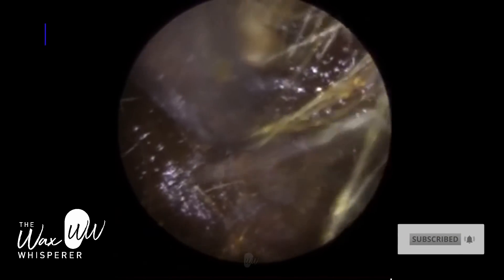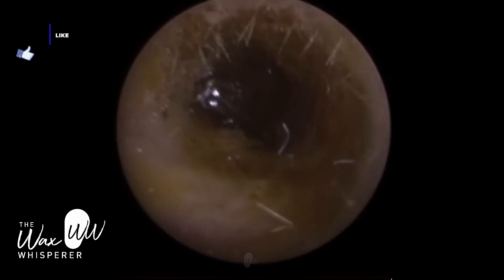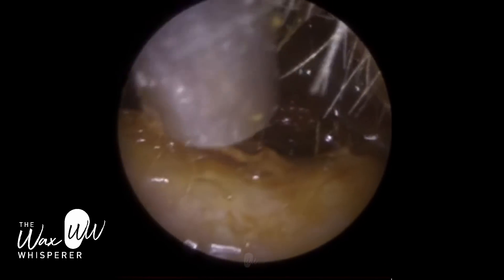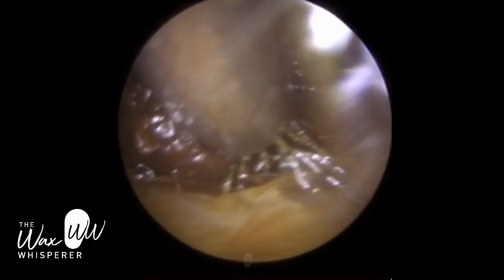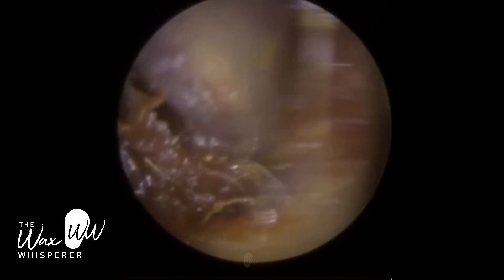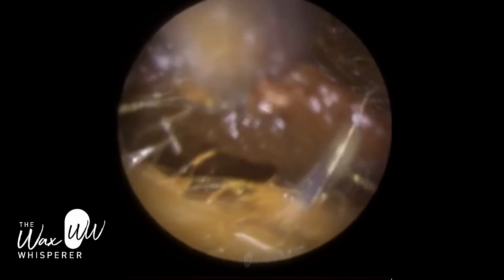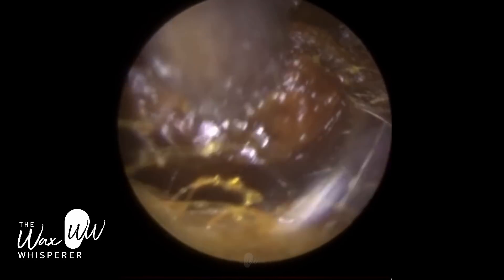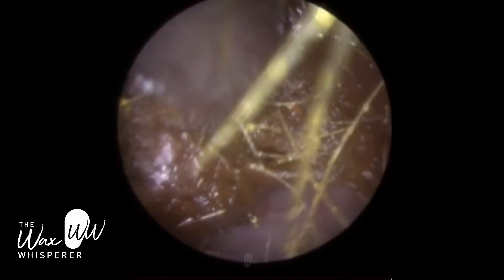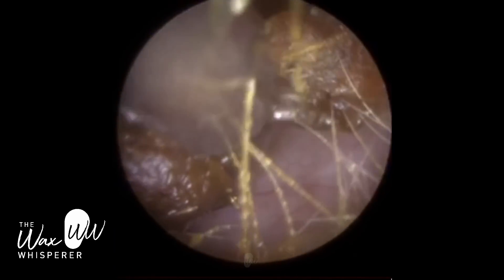This patient attended with bilateral — so both ears — completely impacted soft wet earwax. The consistency of the wax is very similar to the patient whose procedure I uploaded yesterday. It's a very wet, sticky, fudge-type, clay-type consistency. For me it's one of the most frustrating types of earwax because it blocks the suction probe. When you use a Jobson horn, it can almost spread the wax like soft butter on a piece of toast, and it can dissect through the wax similarly with an earhook. You couldn't use forceps on this because the wax is just too soft.